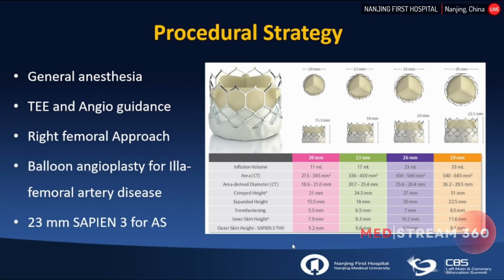Finally, for this particular case, our procedure strategy is general anesthesia with TEE guidance. We will select the right femoral approach. Of course, before inserting the E-sheath, we will do the angioplasty for the right iliac artery disease, then insert the sheath, then do the TAVI procedure with a 23 millimeter Sapien 3 for this particular case.